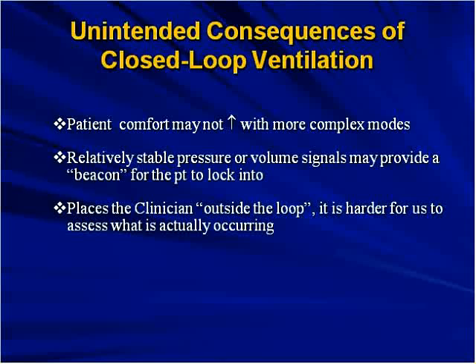Can you comment on inappropriate flow and I time settings? Okay, so for assist control, again, this is also one of the reasons of doing the quick CPAP trial, is that it allows you to see what the patient is trying to do. So normally, you and I have a resting peak flow rate of about 30 liters a minute at rest. And at maximal exercise, humans peg out at a peak flow rate of about 180 liters a minute.